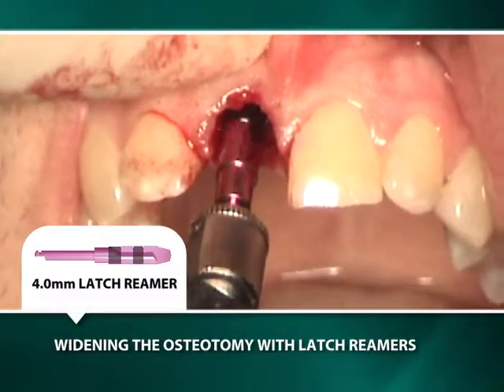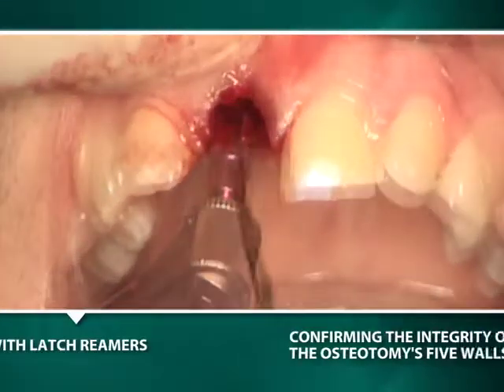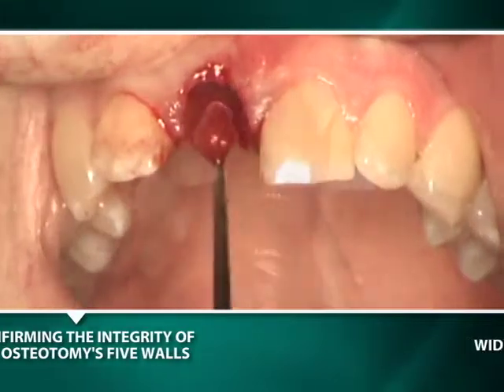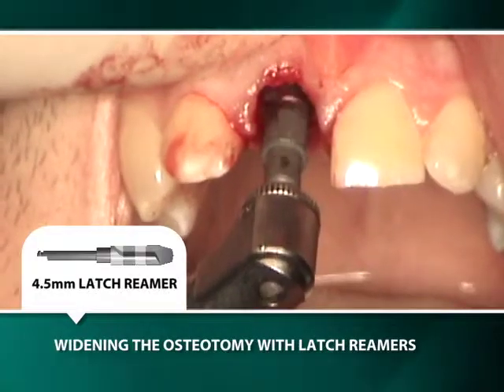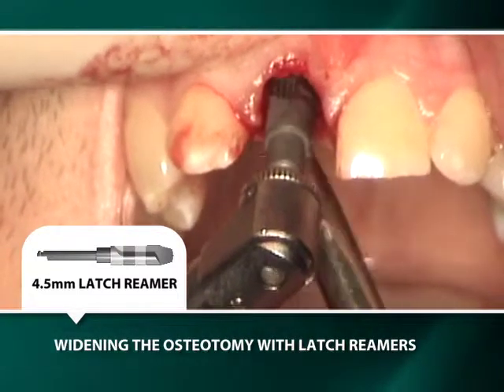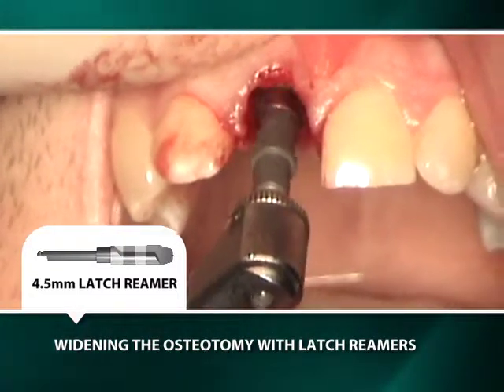Prior to placing the implant, harvested bone is removed from the osteotomy and the integrity of the osteotomy's five walls is confirmed. The final latch reamer is the gray 4.5-millimeter latch reamer, which matches the diameter of the intended implant.